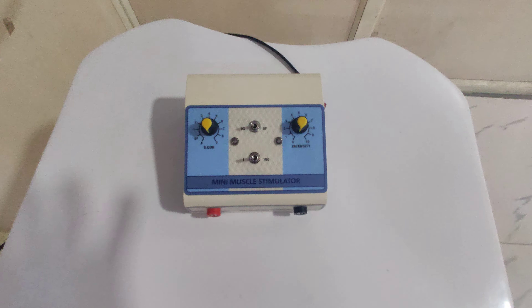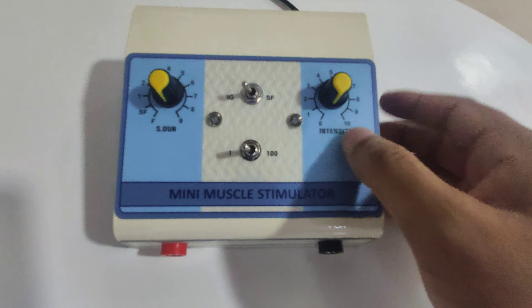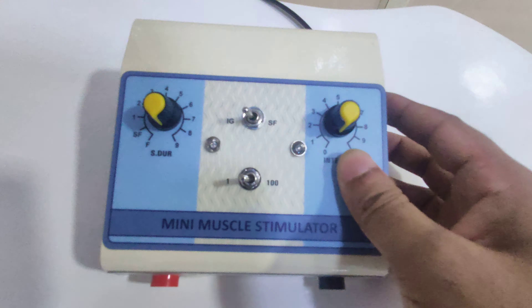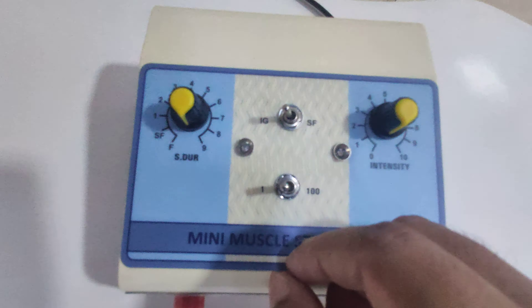Hi friends, today I'm going to tell you how to operate a mini muscle stimulator. This is a metal body machine. Simply switch on the machine from here. We get intensity, time, duration, SF, and IG mode as well.